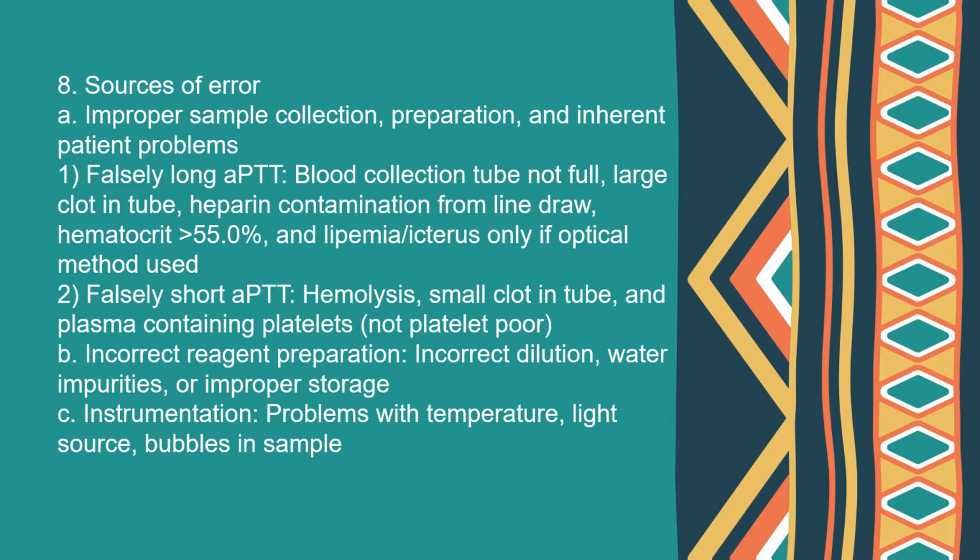And then letter C, instrumentation problems. Right, for example, temperature, calibration of the machine, light source, and the presence of bubbles in the sample.